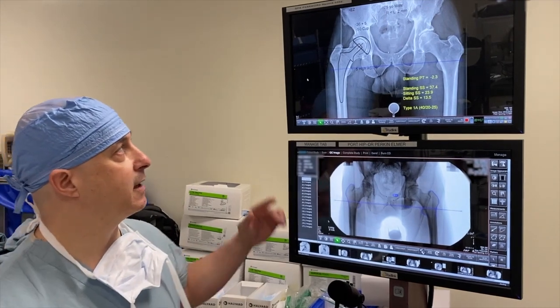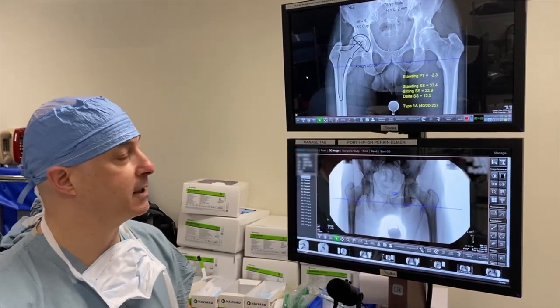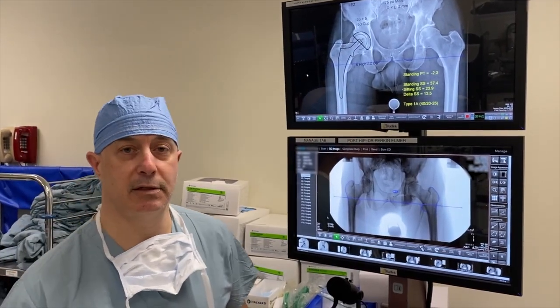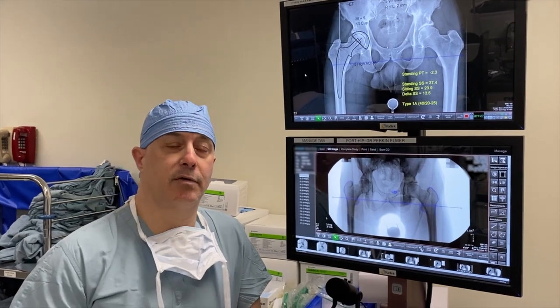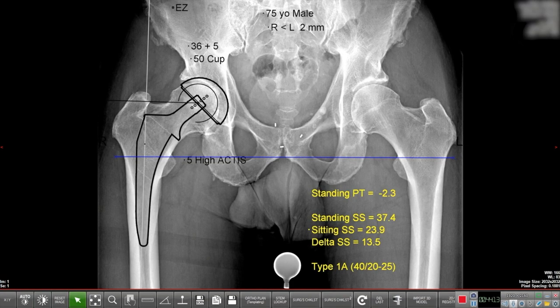This is a 75-year-old gentleman who presented to me with end-stage osteoarthritis of his right hip. We templated him before the surgery, and you can see he's just a few millimeters short on the right side compared to the left by a couple millimeters, and so we're going to try and get just a couple millimeters back in length.